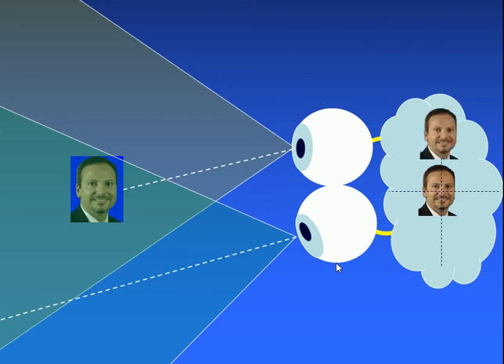And we want to try to quantify that. So what we could do is we could take a prism and put it in front of the left eye, and see what happens. And now the light ray will, through the prism, be shifted over, and that shifting causes the image in the brain to shift, and we see that it's moved but not enough here.